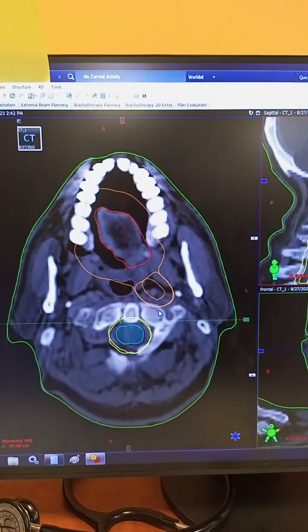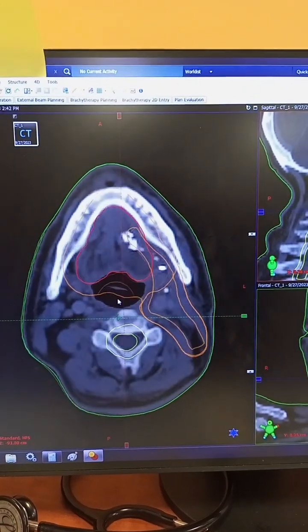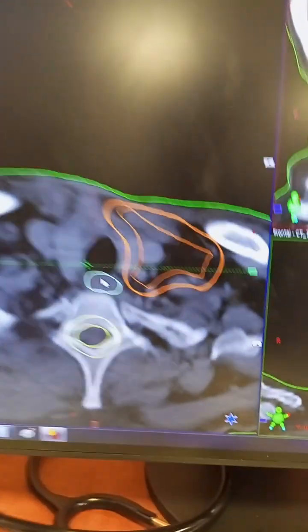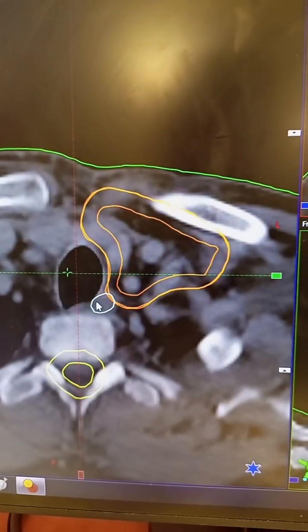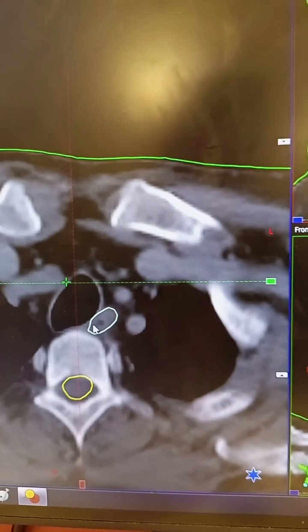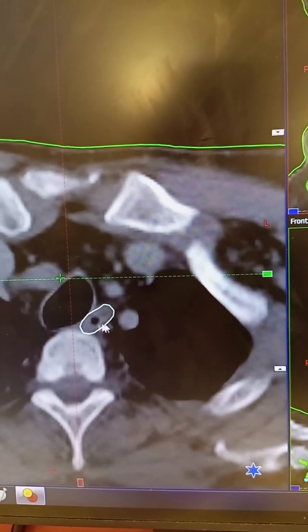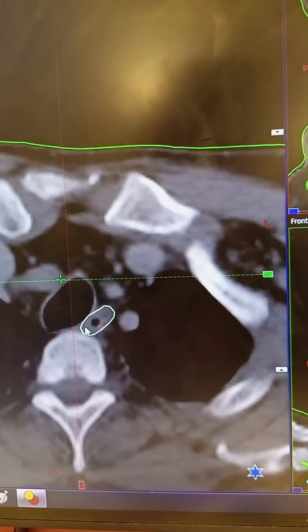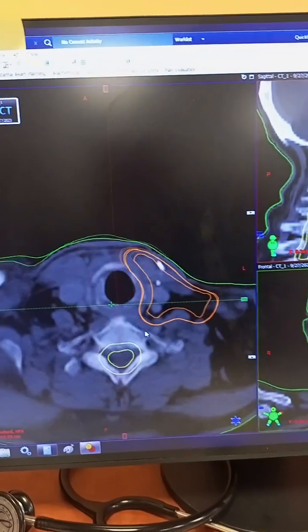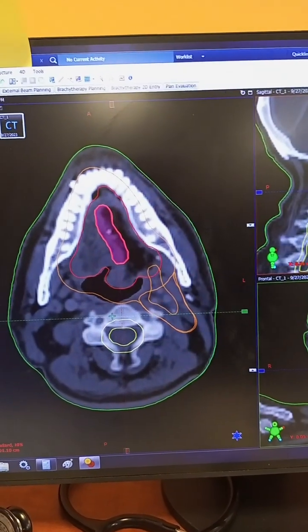We have also drawn the esophagus. The esophagus is located just posterior to the trachea and anterior to the vertebral bodies. This structure shows no air at this point; when a person is swallowing or due to peristalsis it may contain air. This small air-containing structure just posterior and to the left of the patient is the esophagus going toward the stomach — it is also an organ at risk.